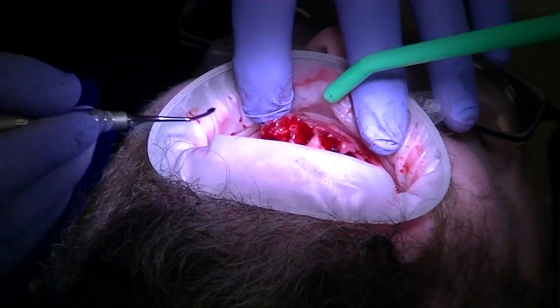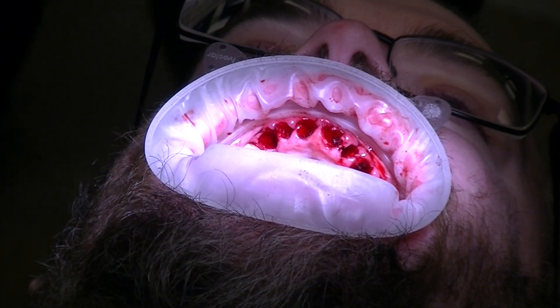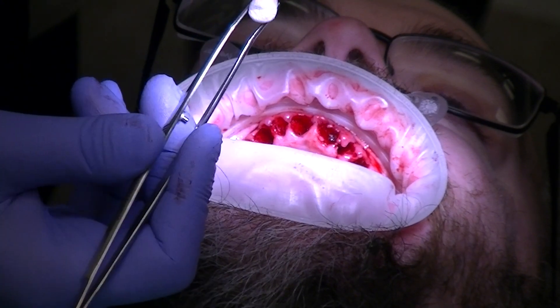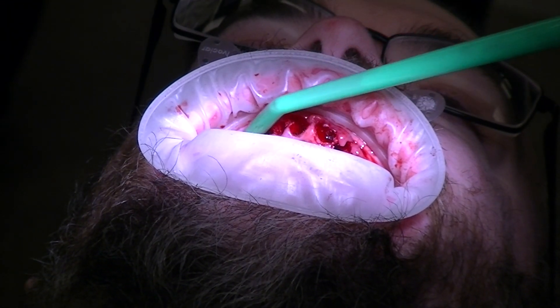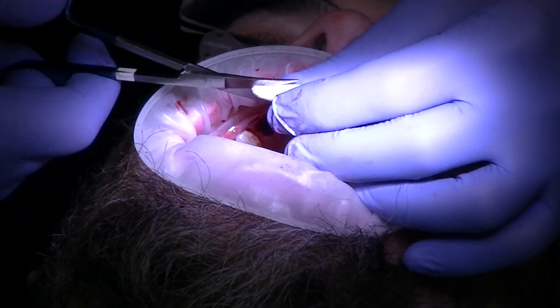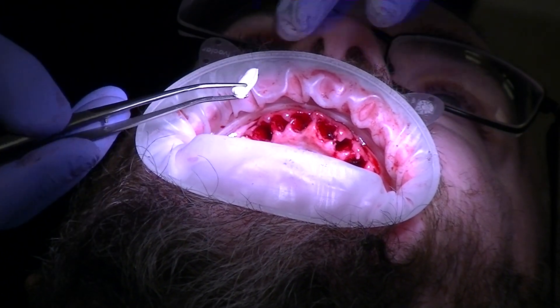One of the things you can do — you're not going to use up all the grafting on one patient — I recommend doing one or two. One option is using the osteogen. Notice what I'm doing with the bullet shape of the osteogen — it's like this. This is too big for even a central, so I'll cut it in half. If you're going to cut it, you may want to flatten it a little bit more. Kevin, I'm giving you a little bone grafting today — you get a bonus.